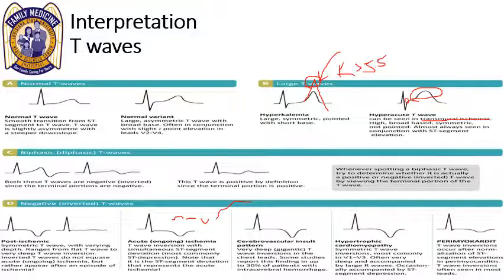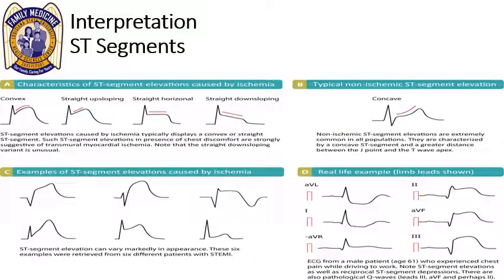One more thing that I wanted to bring into the picture here is a cerebrovascular insult. Whenever you have a gigantic T wave, this does not do it justice. We're talking about the things that look like this on the 12 lead. They're really deep T waves, okay, and that's supposed to be the QRS, I apologize. But those are called cerebral T waves, and that is a very strong possibility that you have a subarachnoid hemorrhage or an intracerebral hemorrhage. So if you see very, very deep T waves, then you know that there's something to be aware of.